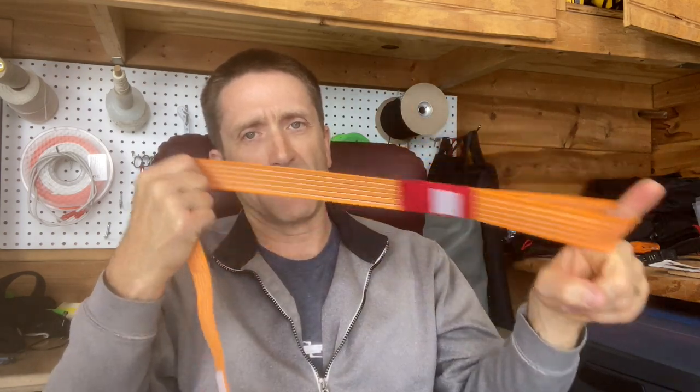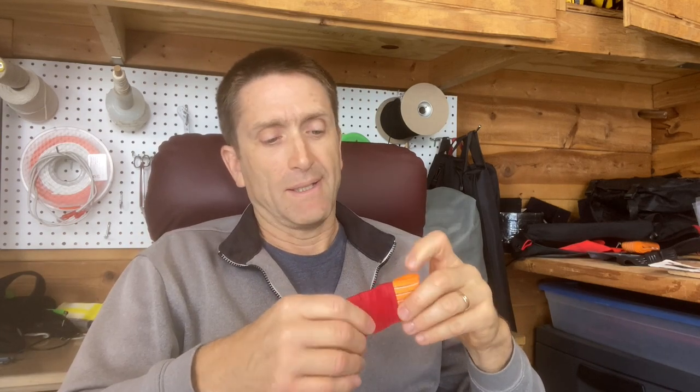I mean, the product will work if it was zero, but it'll unfurl more easily and not hold on as well without any. And then on this end, this slip sleeve is probably the crux of the device. So I pull and I can get it to the smallest of limbs. And that's really important. And frankly, I can see people are viewing the product as a bleeding control device aimed more at kids and dogs and small limbs. So this is a very important part of the product. And if people are thinking of it for small limbs, then it doesn't need to be longer.